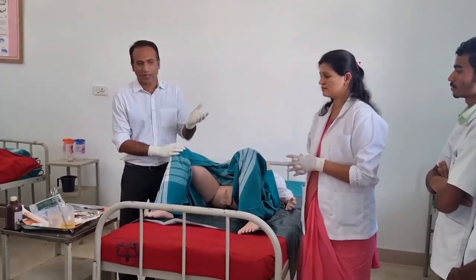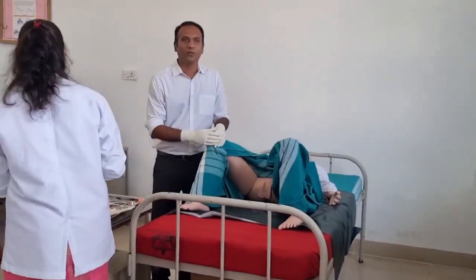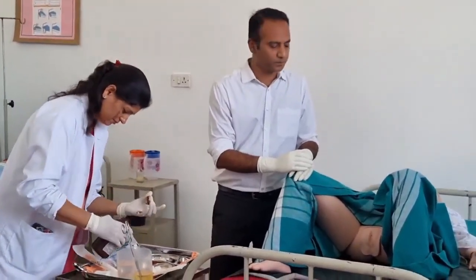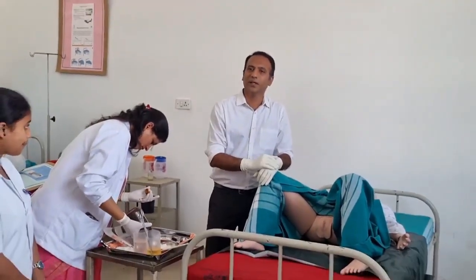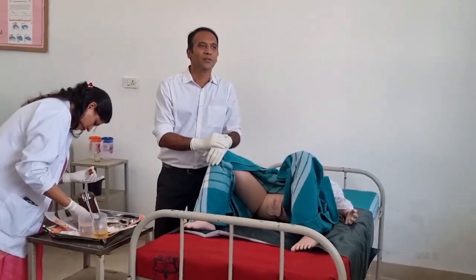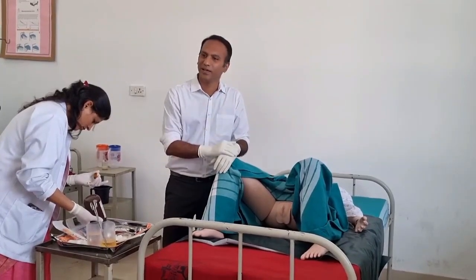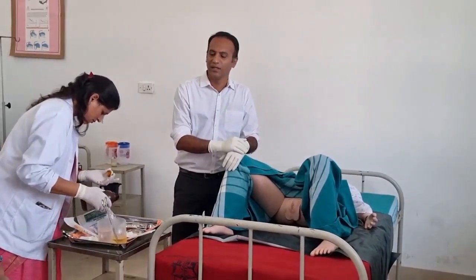Now I ask madam to pour the betadine solution into the bowl to start the cleaning process. Remember, you have studied in other topics that the cleaning technique always follows the principle of cleaning from the area of lesser contamination to higher contamination. The same thing you are going to see here.